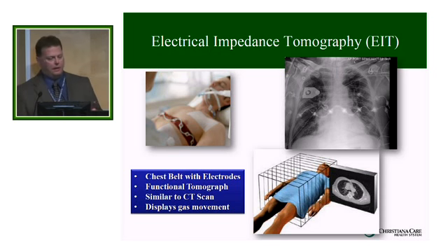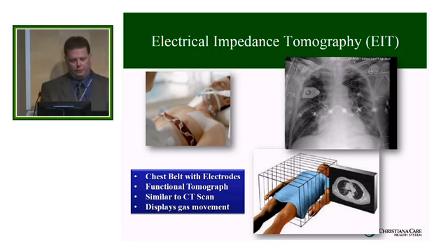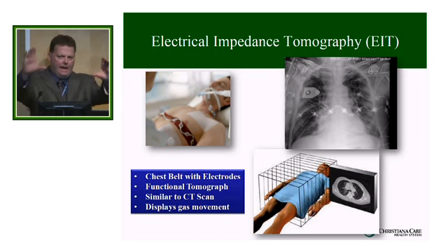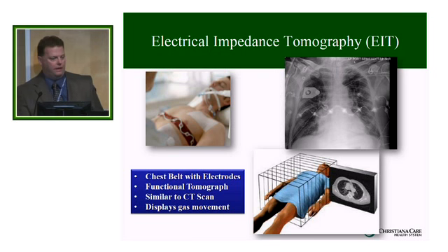And what I do want to say is, don't get mixed up in a couple of images I'm going to show you that it's a chest x-ray. It's really a CAT scan slice. So think of it as a band going around the patient, and you're getting a CAT scan slice of right around where that band is on that person's chest. Okay, so you're getting a CAT scan slice.